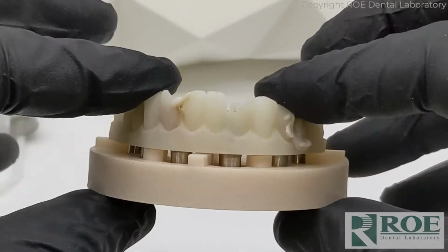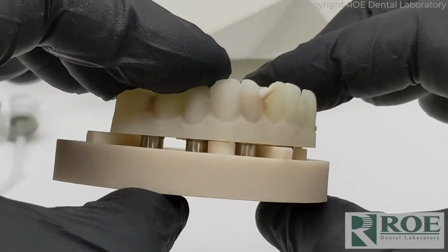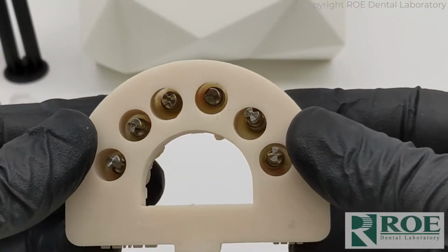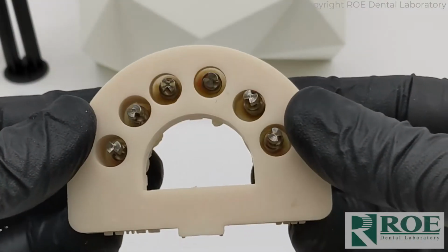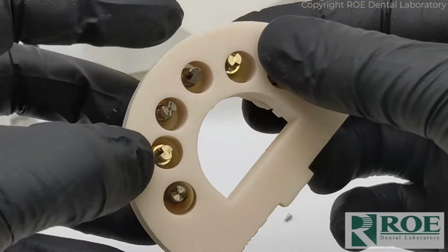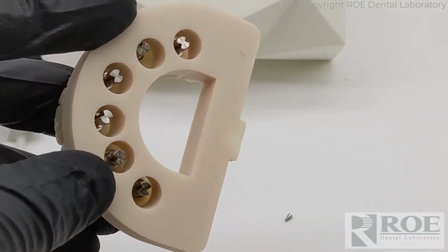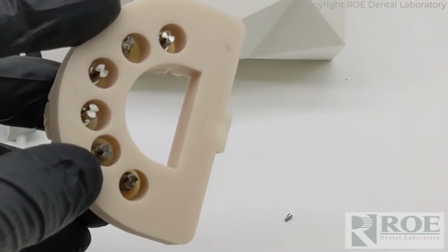Okay, so here's another check. It's still down, so we know nothing's holding it up, and the copings are all in their proper position right in the middle of the holes. So the next step will be to hold the two together and then just simply backfill to connect the analogs and basically make an implant model.